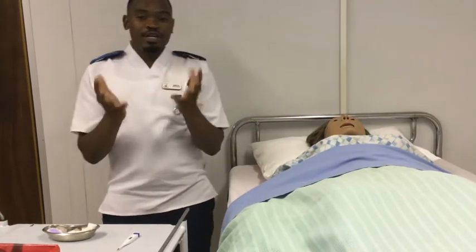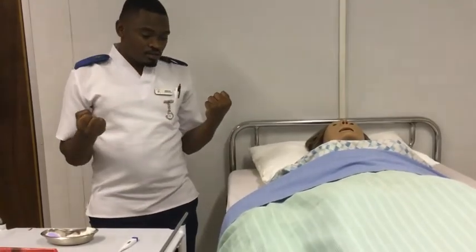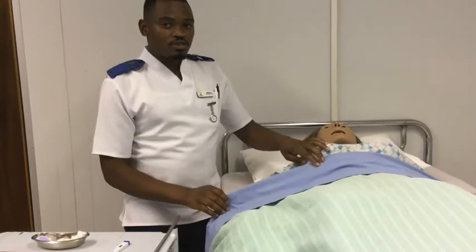Alright, so I have managed to wash my hands and perform social hand washing. So now we are going to start by cleansing the armpit with the dry swab.